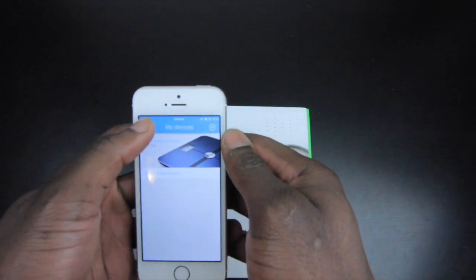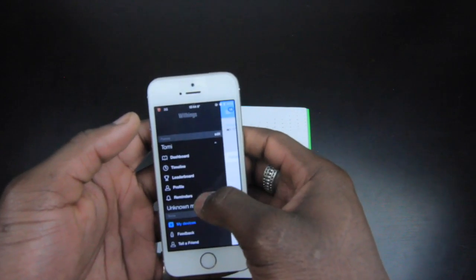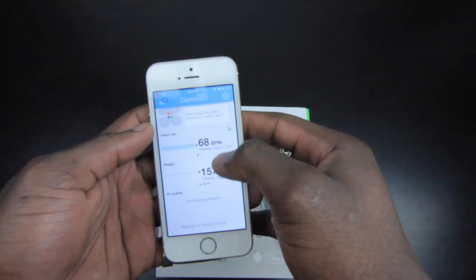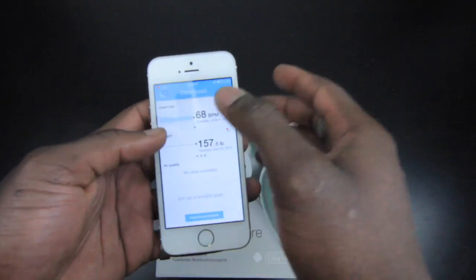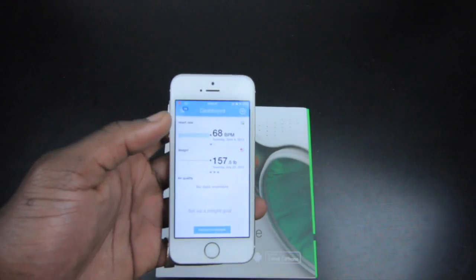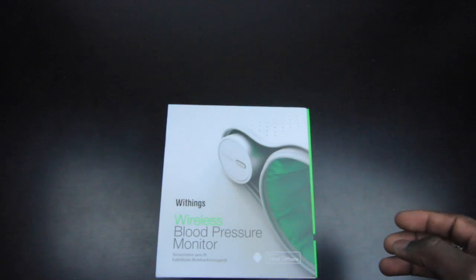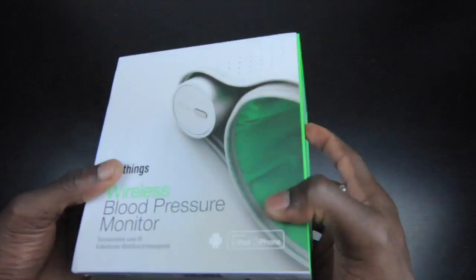You can check your devices — I've got the Smart Body Analyzer hooked up already. You can give feedback, and the main dashboard gives you everything you need to know: your heart rate, your weight, and the air quality, which comes from the Smart Body Analyzer that I covered previously on this channel.